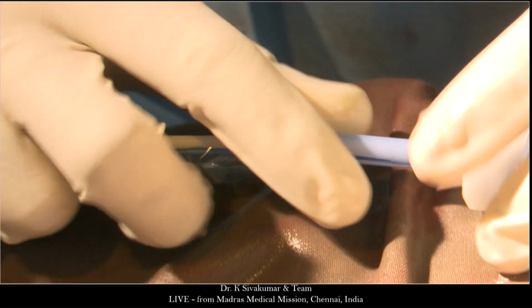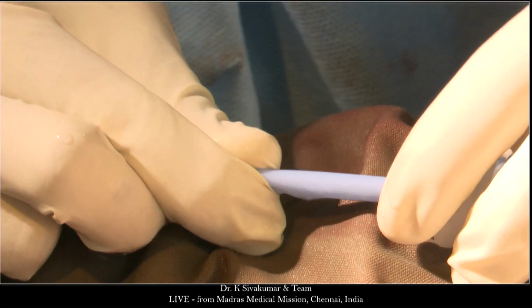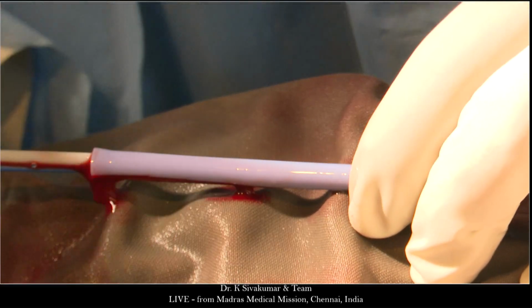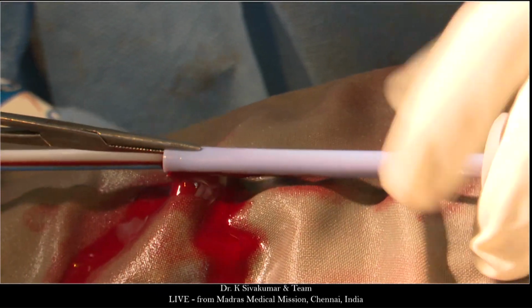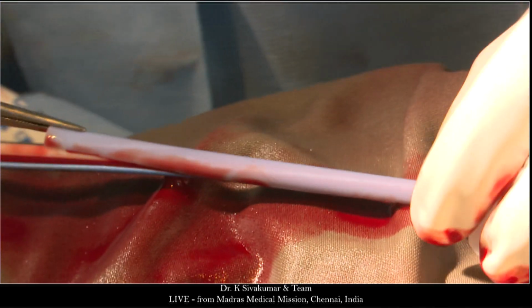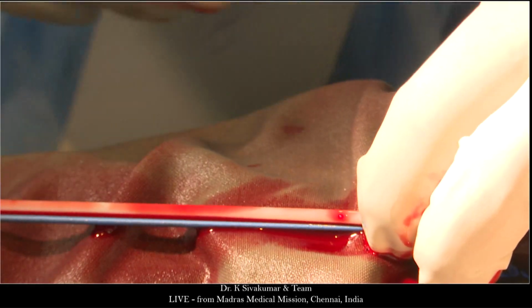I want one. I'm just removing this sleeve. One artery forceps here. So I'm peeling away this sleeve.